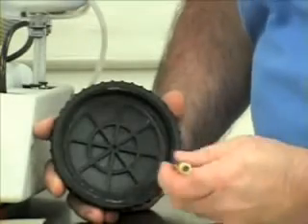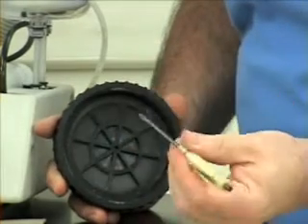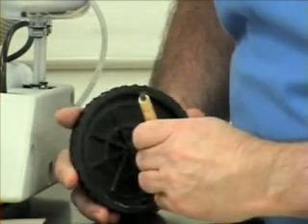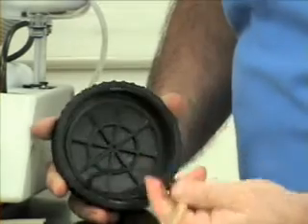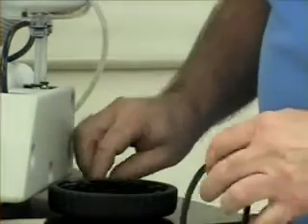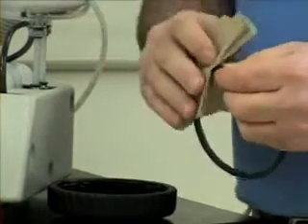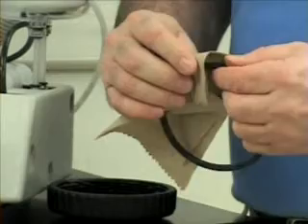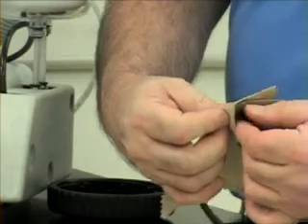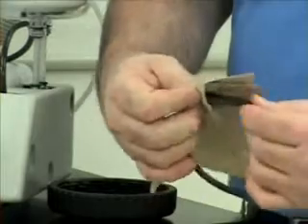Okay, now we're going to demonstrate how to specifically clean and replace the ring. I have just a plain pocket screwdriver here, about an 1/8 wide tip, just anything that can compress the ring slightly and allow me to pop it loose, and it comes right out. Then I'm going to set the lid aside temporarily for a second, and I'm going to take a dry paper towel. It's important that the paper towel be dry and not wet, because if it's wet, it will cause beads to adhere to it. And I'm just going to pull the O-ring through it slowly and make sure I'm gripping it on all 4 sides, so I'm just going to wipe every surface of this O-ring and slide it through. That's all that's necessary.